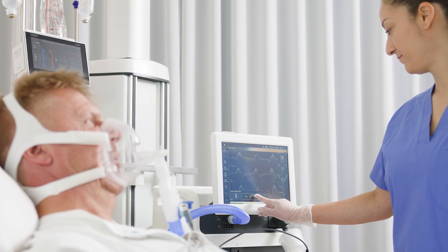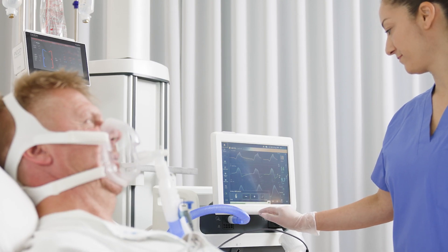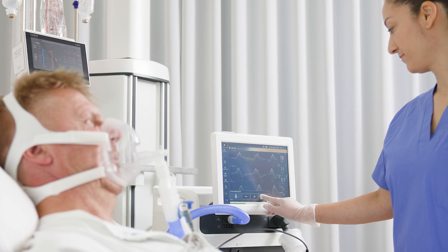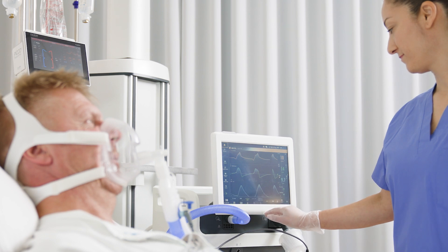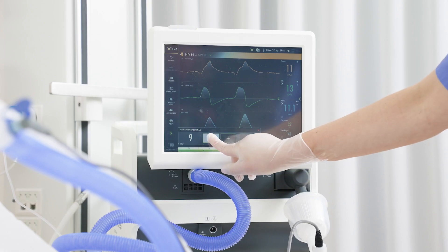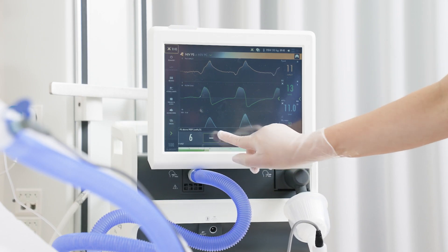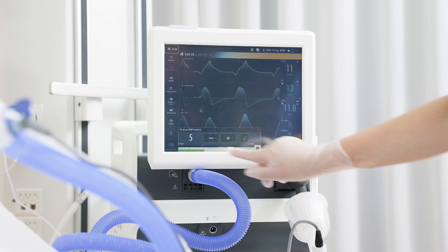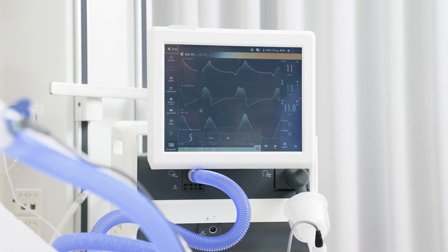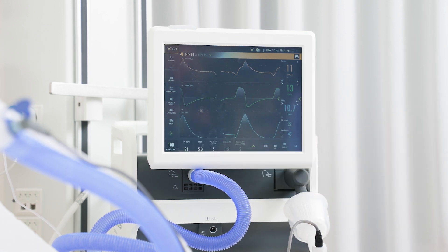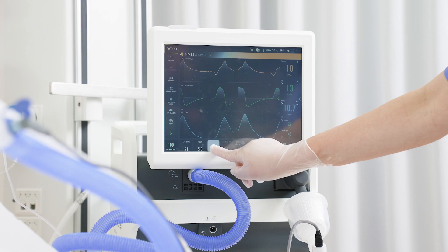By using the direct access, the settings can be quickly changed. Progressively increase the PEEP and the pressure support in small steps, giving the patient time to adapt.